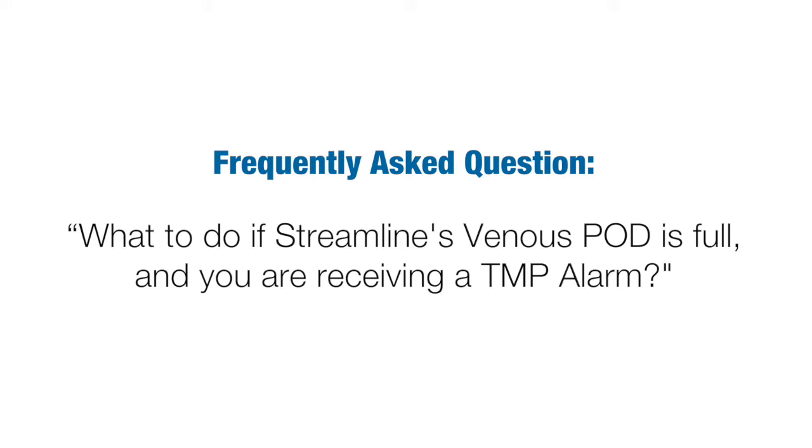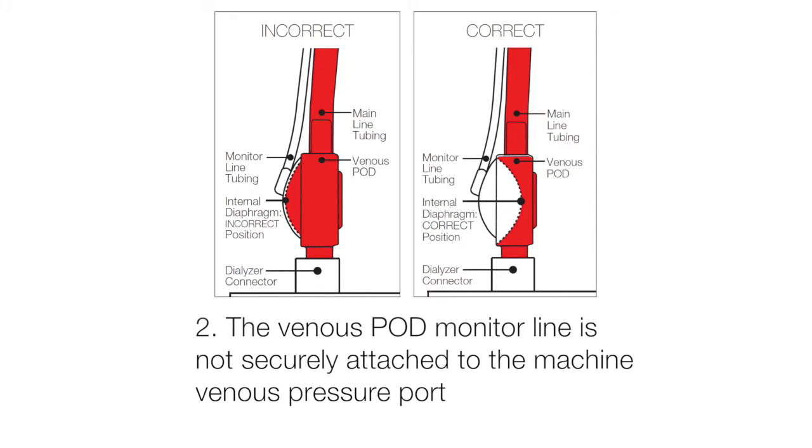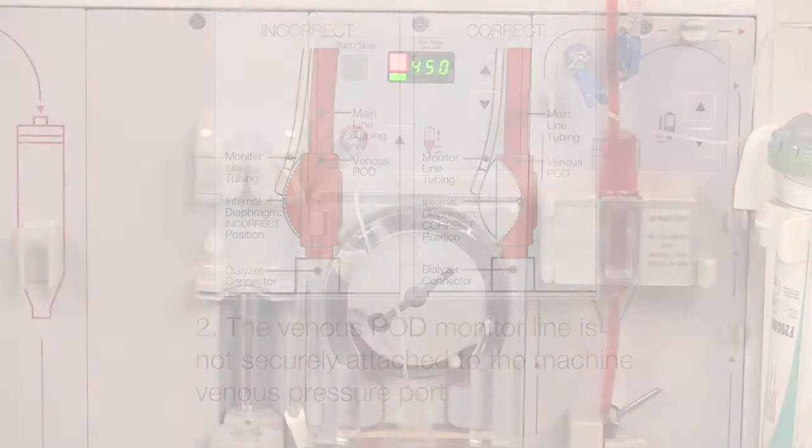Today, I'm going to discuss a question we sometimes get, which is what to do if Streamline's venous pod is full and you are receiving a TMP alarm. Two reasons why this might occur. One, during the priming process, the venous pod monitor line clamp was left open. Two, the venous pod monitor line is not securely attached to the machine venous pressure port, allowing monitor line air to escape and the diaphragm to move to the dome of the pod, with a lower than expected and or zero venous pressure display.